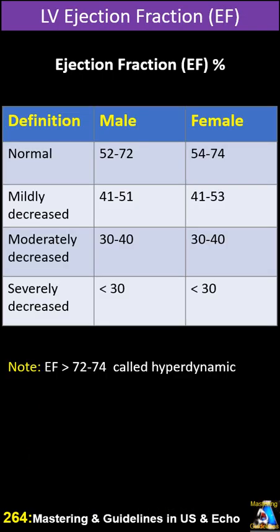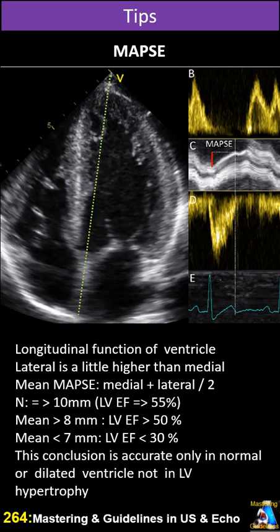Here we have the normal and abnormal value for ejection fraction of left ventricle. In two other clips I mentioned ejection fraction, eyeball guessing and tracing endocardium in detail.